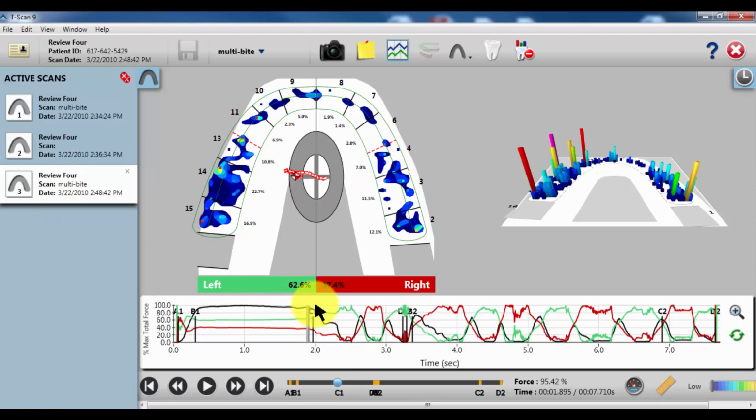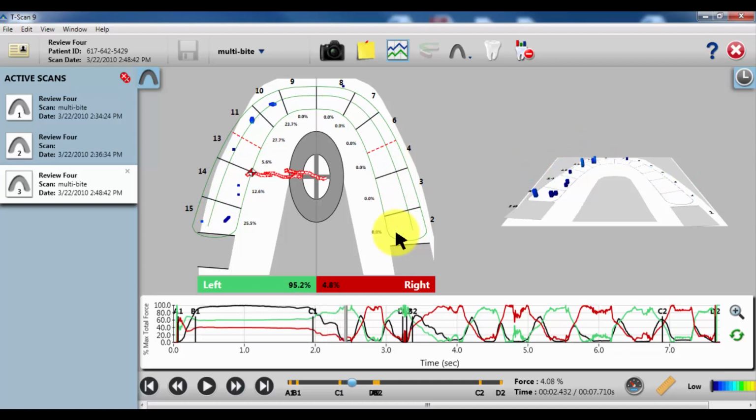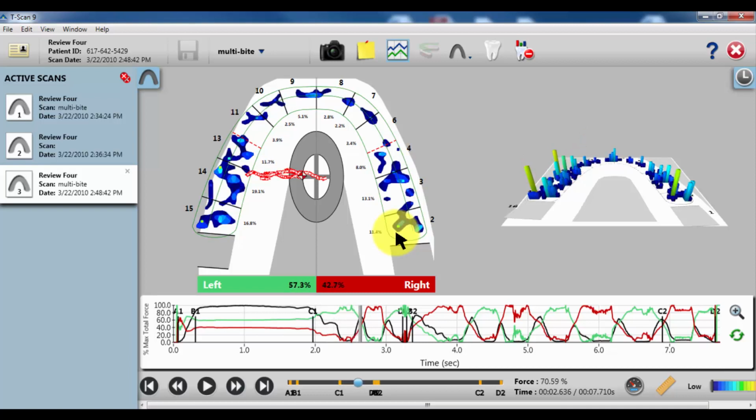and you can see it here on number 2, that the forces are lower already. It's a light greenish color. And if we play it a little bit, there's your pull to the left, and then your pull to the right, and the forces stay significantly lower.